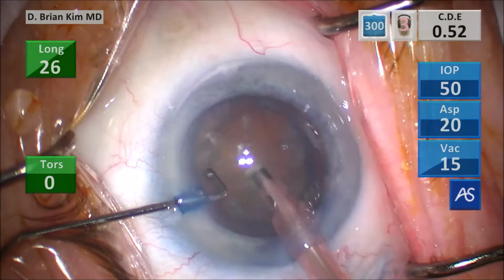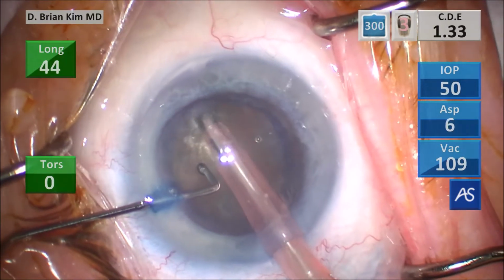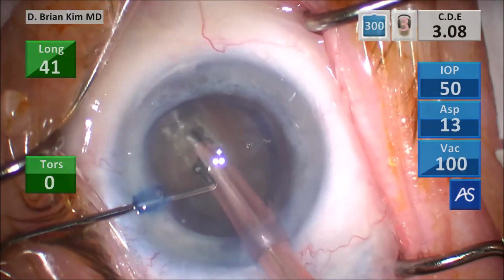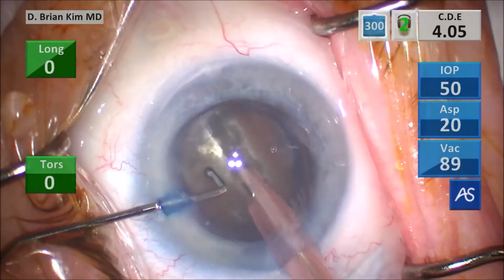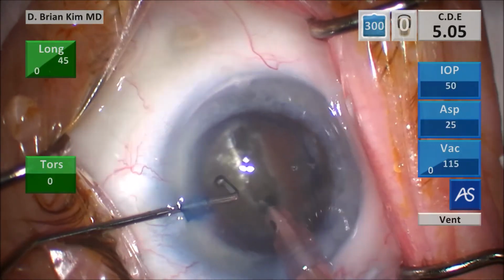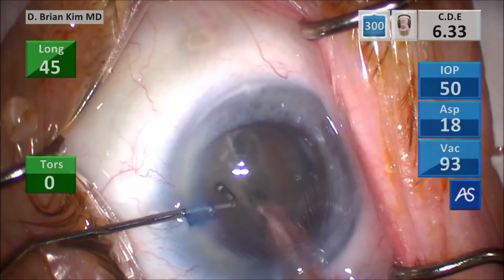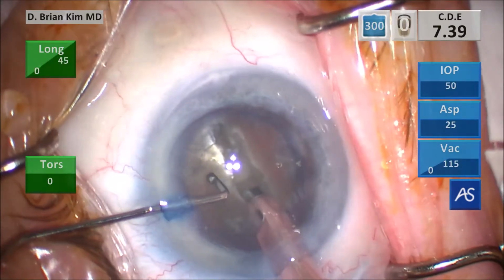I don't have to make a really long trough. About the diameter of the rhexis is fine. Widening just a little bit as I go. And you only want to apply ultrasonic energy moving forward. And I'm just very gingerly making sure I'm debulking the center mostly. You want to debulk the sides as well, but really you want to concentrate on debulking the center.